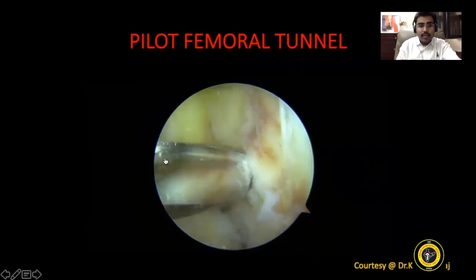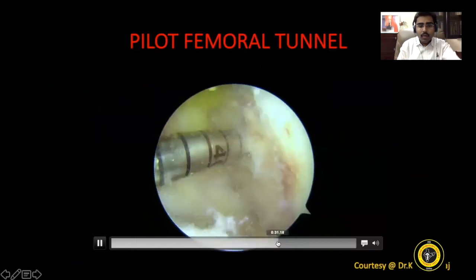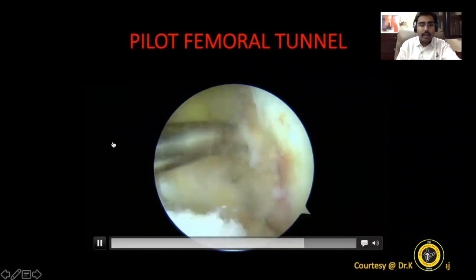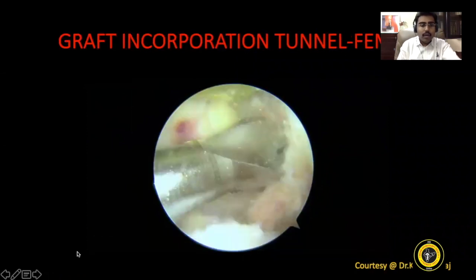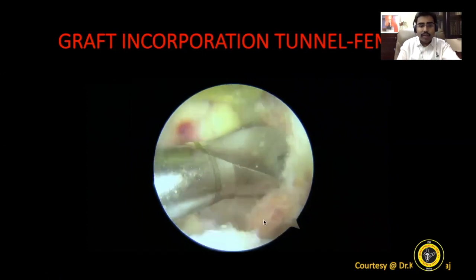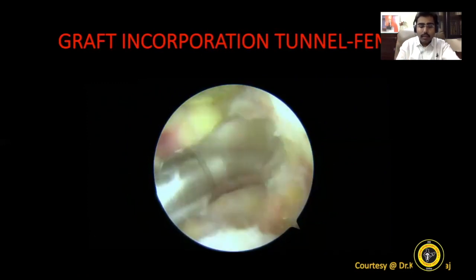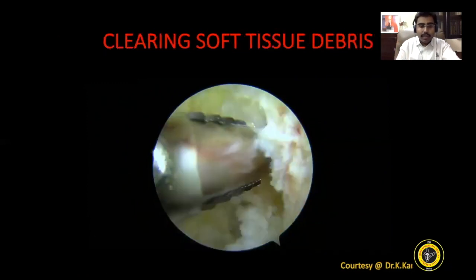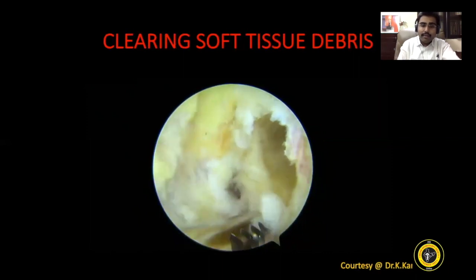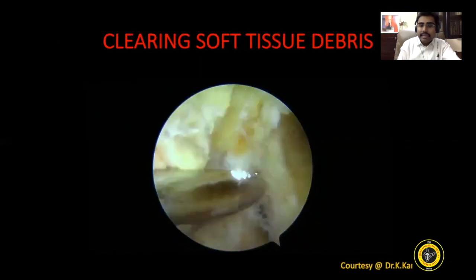Once that is done, we start the pilot hole with a 4.5 mm tunnel, also simultaneously measuring the tunnel, which is normally 40 to 45 mm. Once that is done, we go ahead with the graft tunnel, which in this case, I think, is a 9.5 mm tunnel. I always like to have a 25 to 30 mm socket for the graft incorporation. I like to clear the soft tissue. This is the kind of view I love to have, with the soft tissue cleaned, a neat tunnel there.